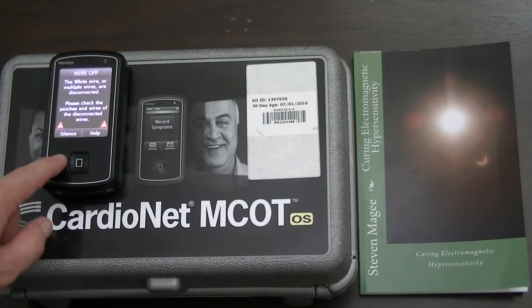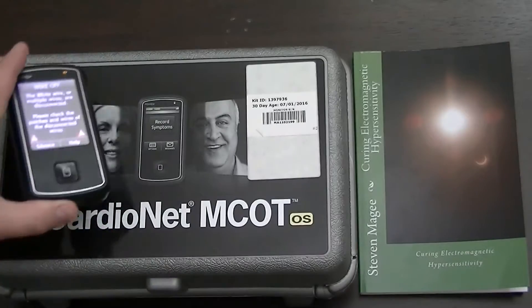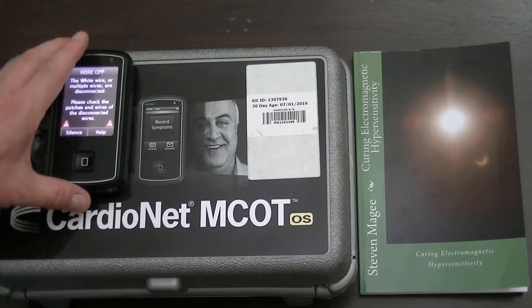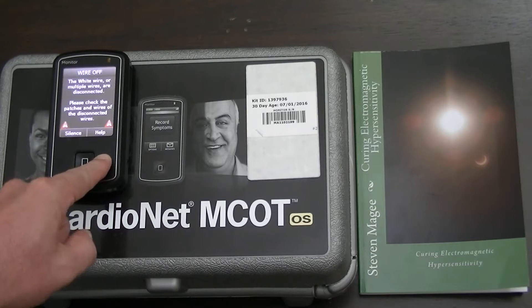As you can see, we actually have a message on this monitor informing us that we have a wire off the pendant. This device comes in two parts. The main part is a cell phone that transmits the readings to CardioNet. The other part is worn around the neck and hangs above your chest — it's a pendant device and a wireless radio frequency transmitter which communicates with this box and sends it your heart meter readings. This device is commonly referred to as a Holter device in the medical profession.